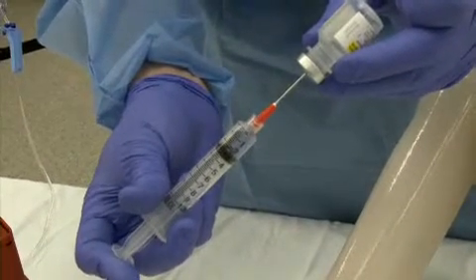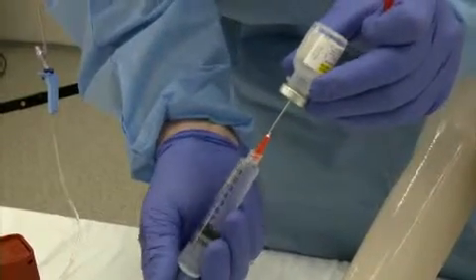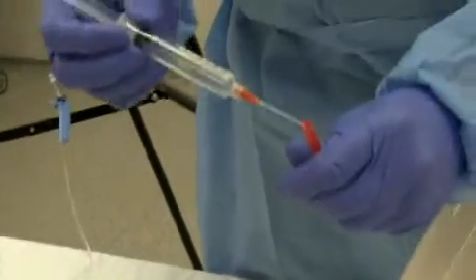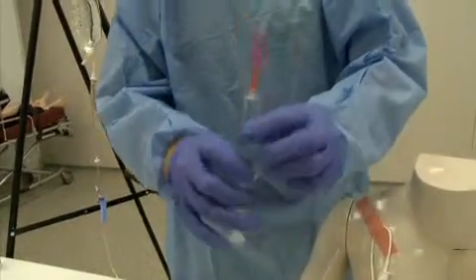Uncap and cleanse the port of the normal saline vial. Withdraw 10 cc's of normal saline and express any air left in the syringe. This will ensure that air is not infused into the CVAD line, which can lead to an air embolism. Maintain the blunt access needle in place and set the syringe and access needle aside until needed.